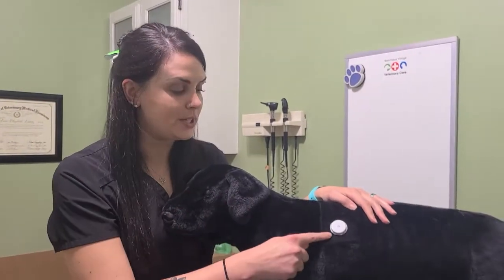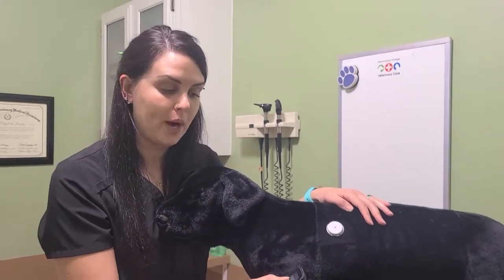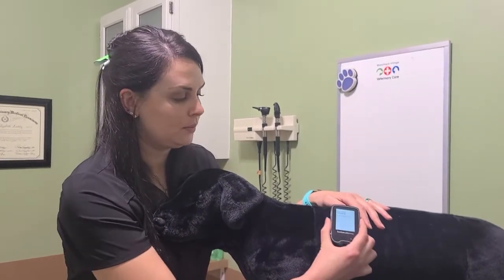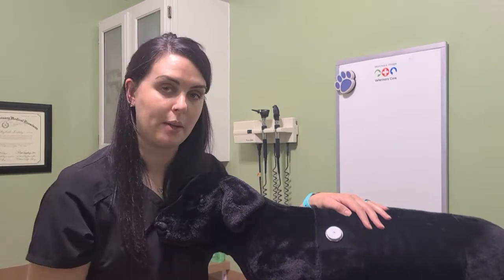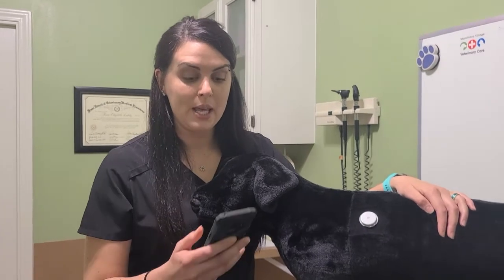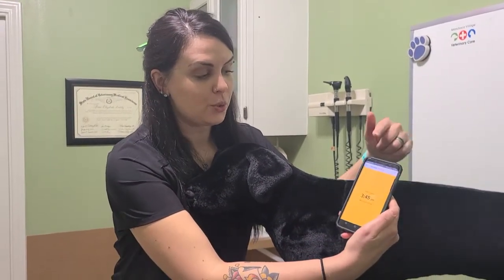Now Rover has its Freestyle Libre sensor. You can scan your reader right over your new sensor and it will take about 60 minutes to calibrate. After that calibration you can scan over at any time and it will give you an immediate reading. If you have an iPhone 7 or newer you can download the Freestyle Libre app, scan the back of your phone to the sensor, and get the readings immediately.